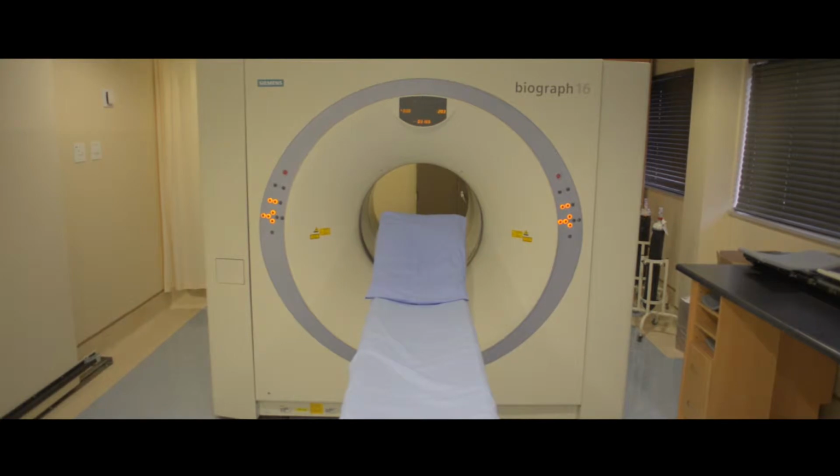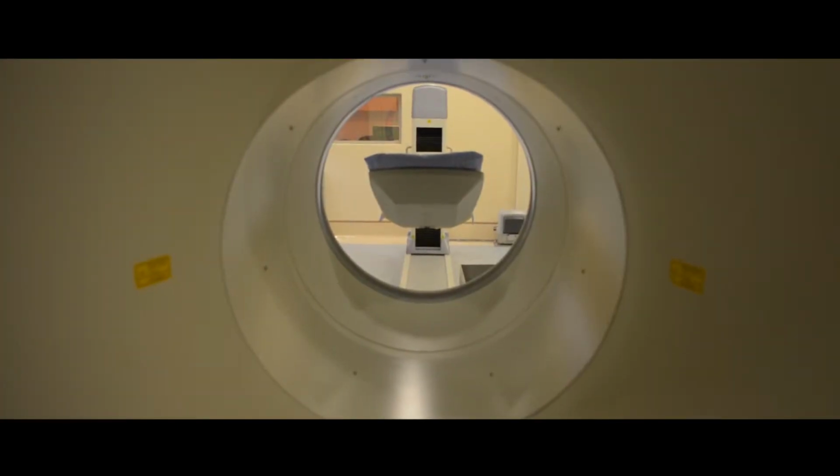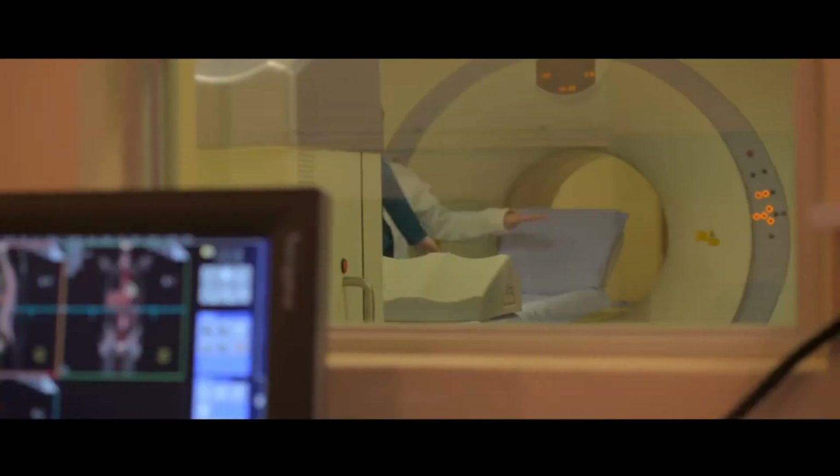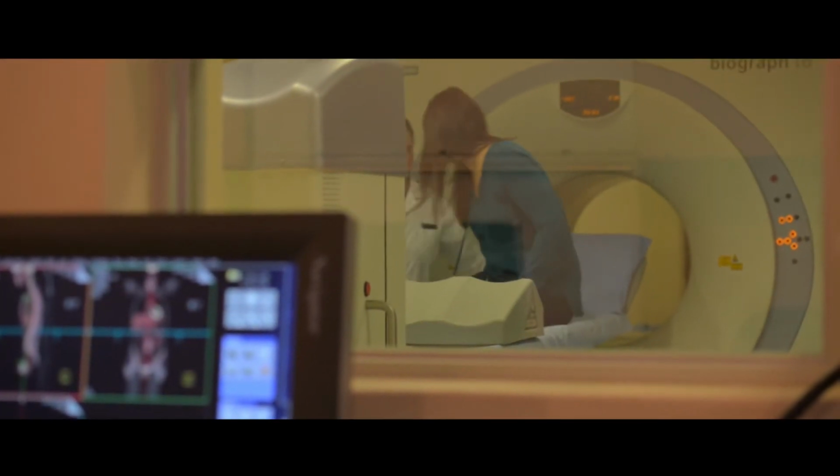Then we will inject you with a radioactive glucose. The injection won't make you feel funny, it won't make you feel sleepy, there's no side effects from it. After the injection, we ask you to sit still for an hour while this radioactivity gets taken up into all the cells. We will then put you on the scanner.